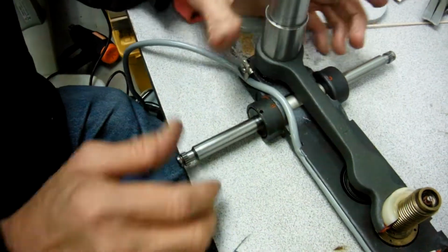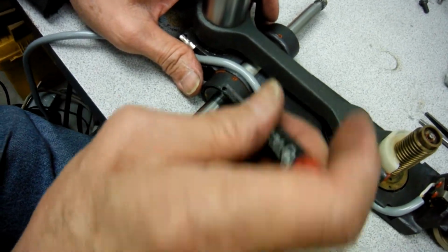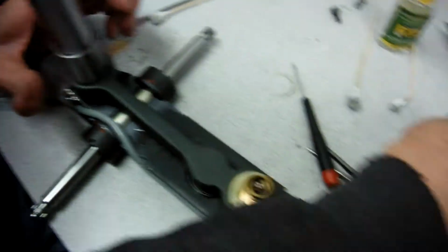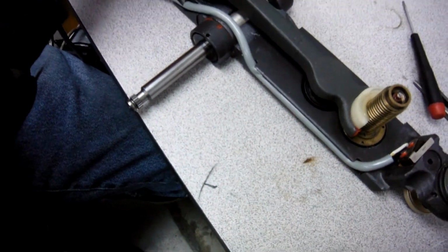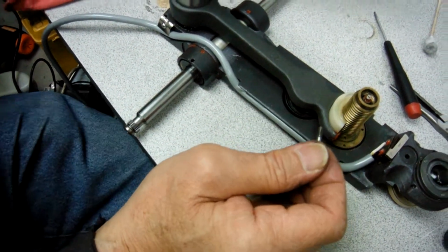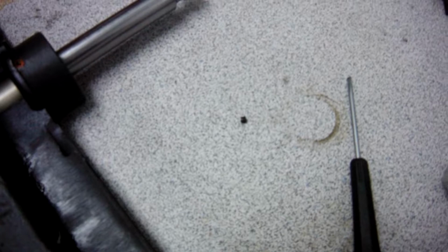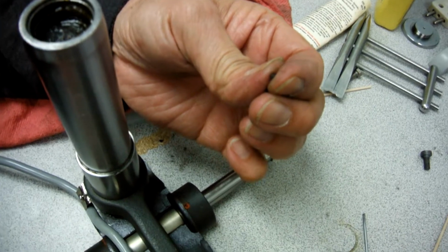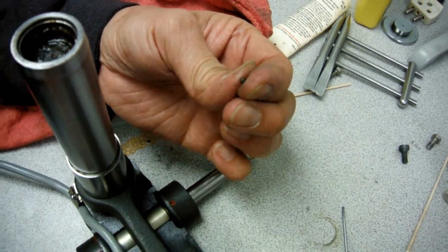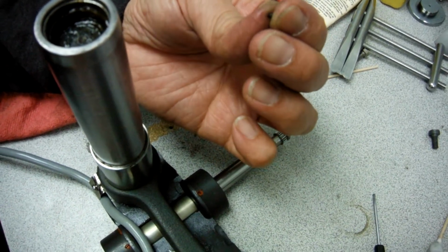Okay, and this piece right there, before you can see both sides, they have a spring, and in the center, that's where the lock screw goes into it. This lock knob goes into that. But between the shaft and the lock screw, you have what they call a pressure piece. It's made of copper, and it's about this little thick right there. I don't know, about 3 millimeter diameter and 3 millimeter height.